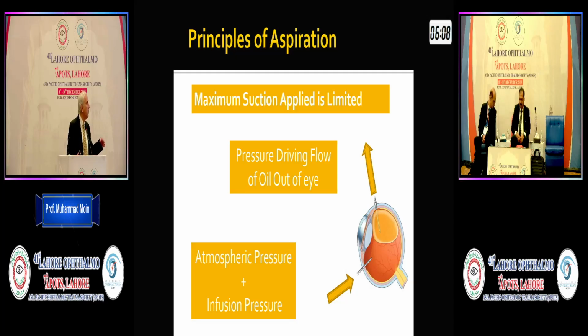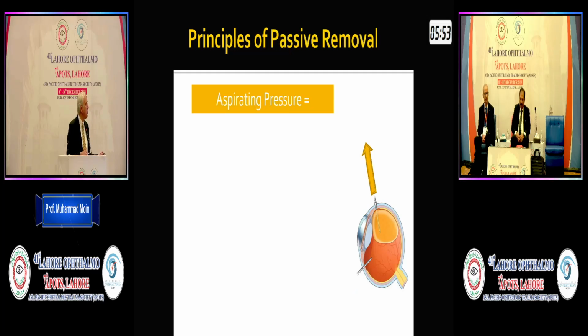So the oil moves to the other side, and removal of oil is just removing curd, or like malai, which floats on top of milk. Similarly, when you put fluid in the eye, the oil is going to float up and go out from the other port over here.